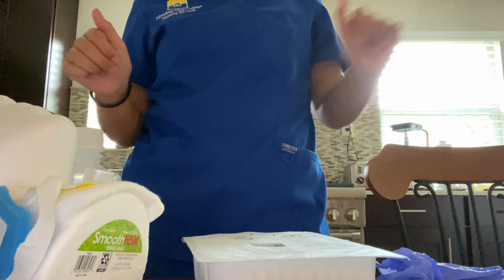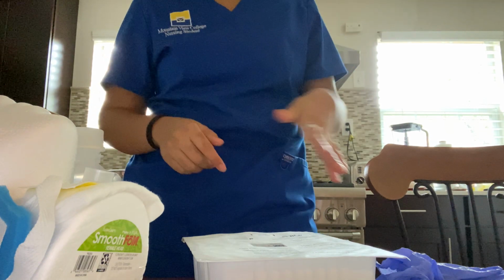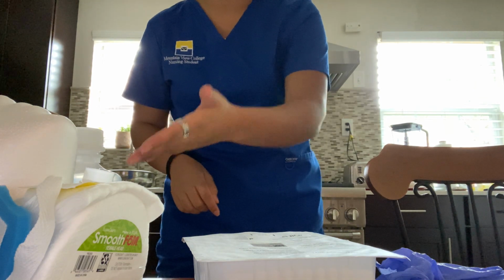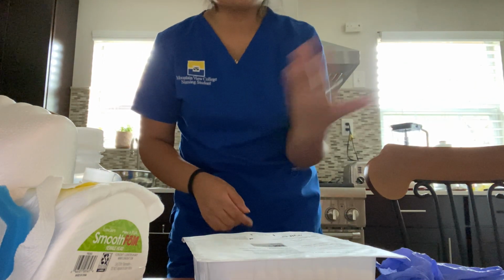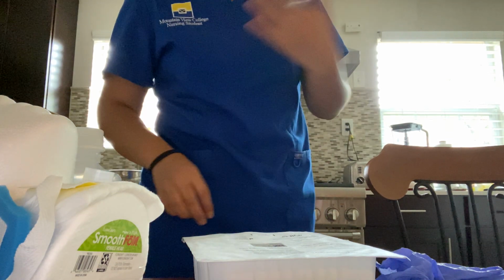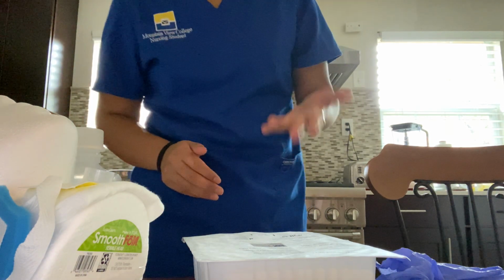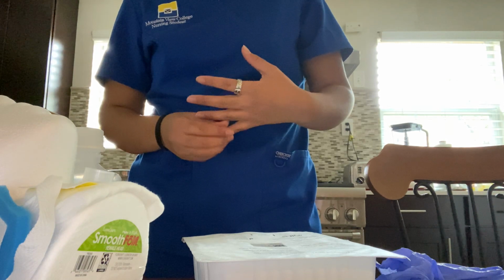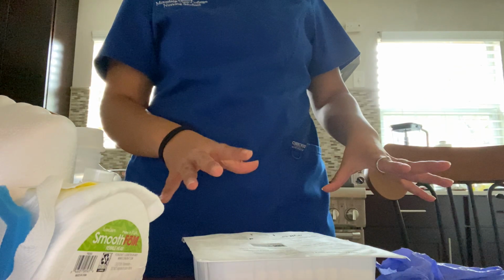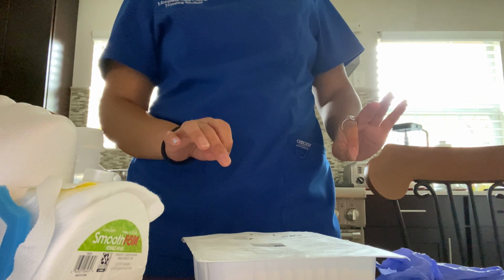The privacy has been provided. We perform hand hygiene. And if you need any PPE to put on, sometimes the patient may cough and some phlegm may come out of their trach. So you can put goggles on or contact isolation gowns, just to be careful, because you never want to stand directly in front of it. You always want to stand on the side if they cough. You don't want all that coming at you. So you're going to use a sterile table. All this is sterile here. We're always going to maintain sterile procedure because that's very important.